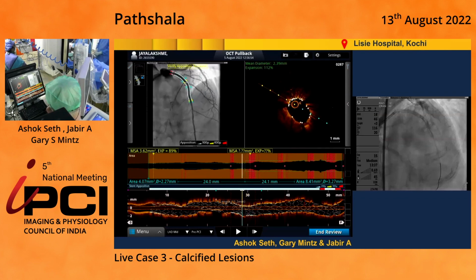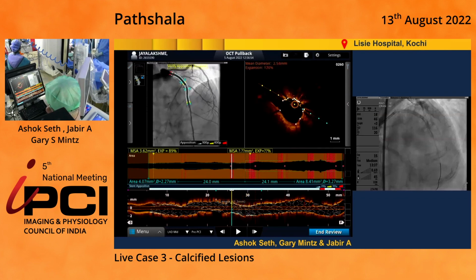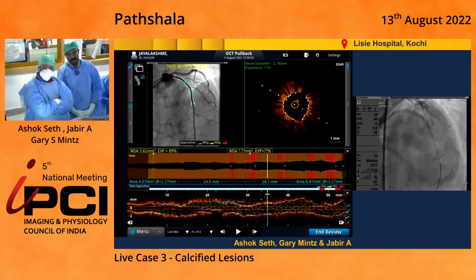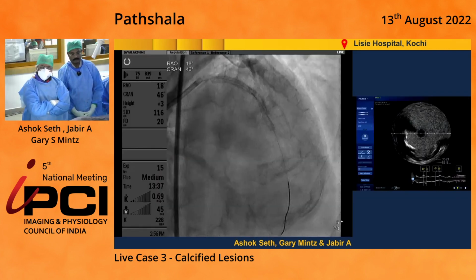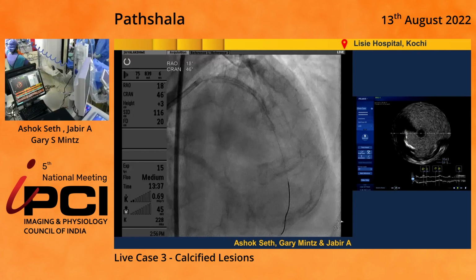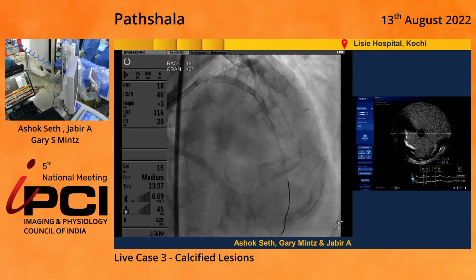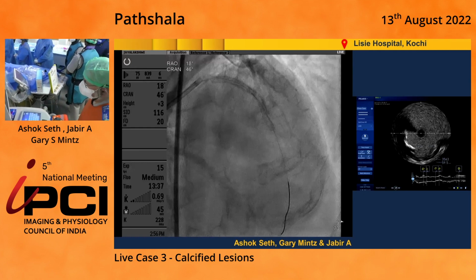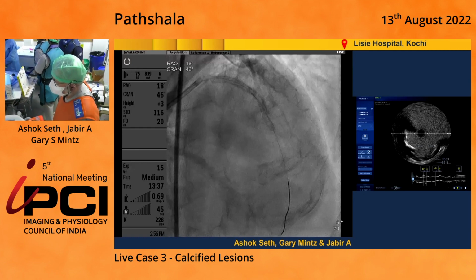All right, perfect. So Gary, thank you so much for showing us the IVUS and the OCT and highlighting some of the challenges that we're probably going to have with this case. Just to recapitulate the clinical history, this is a patient that had ACS, had 2 recurrent stent thromboses, the most recent of which the patient just underwent POBA, and now is on the table. It looks like there's at least one area of stent underexpansion where there's overlap of the prior stents, and then potentially some underexpansion at the site of the original calcific nodule.